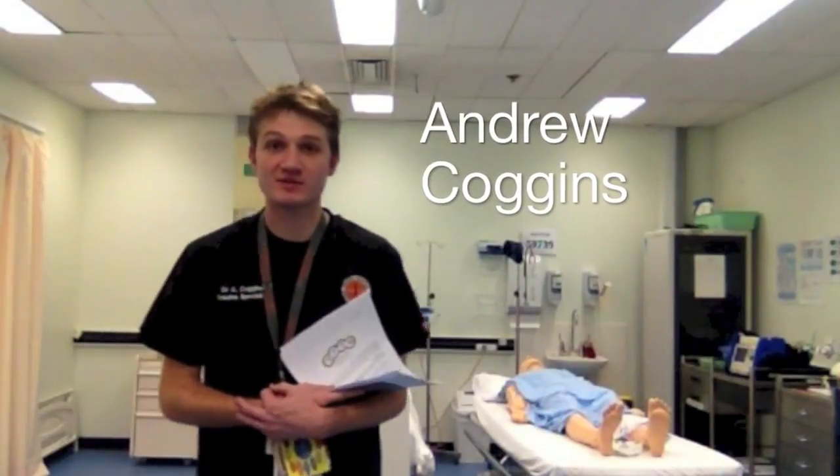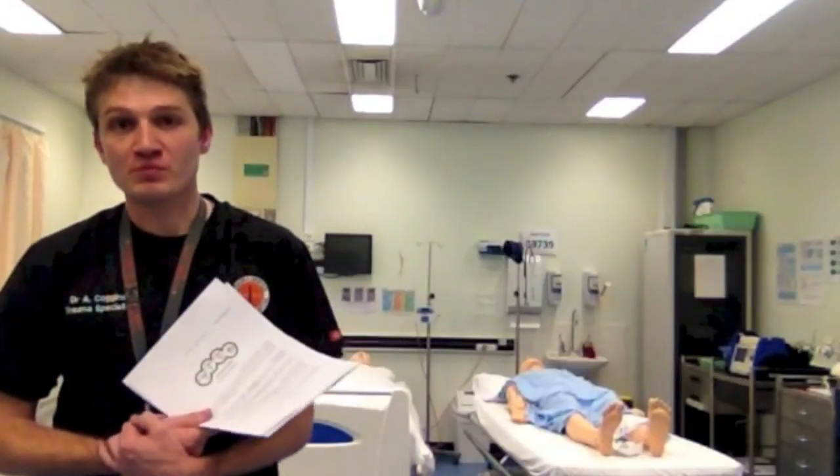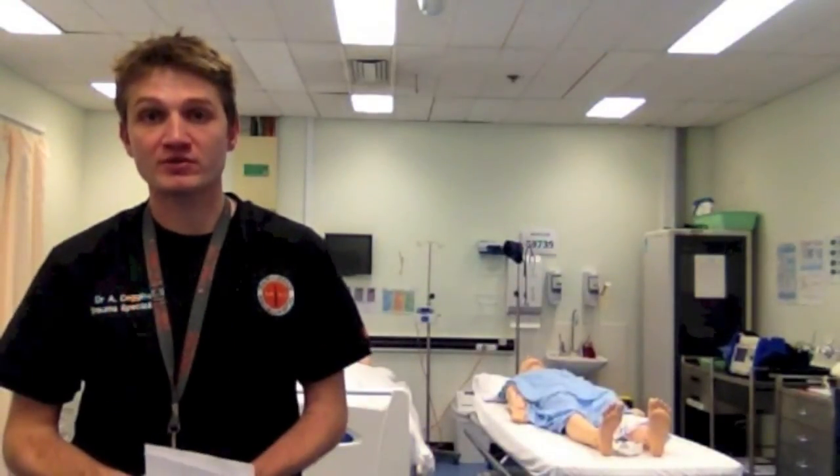My name is Andrew Coggins, I'm one of the ED staff specialists here at Westmeet. I'm going to do a few minute video here and talk to you about the mechanical autopulse.